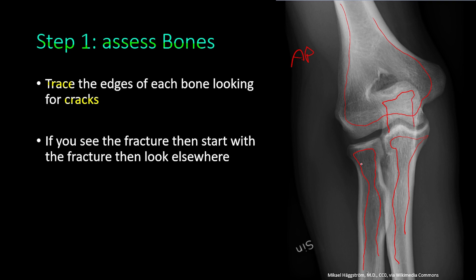We pay more attention when checking the radial head and neck because those are a common area of fractures. We also check the areas of superimposition — that is, the area of the joint — as it is easy to miss a subtle fracture there. If you see a fracture first, assess it and then look elsewhere on the x-ray.